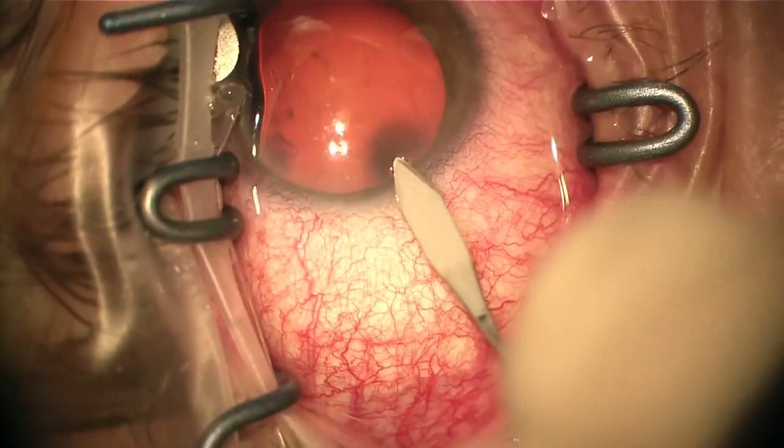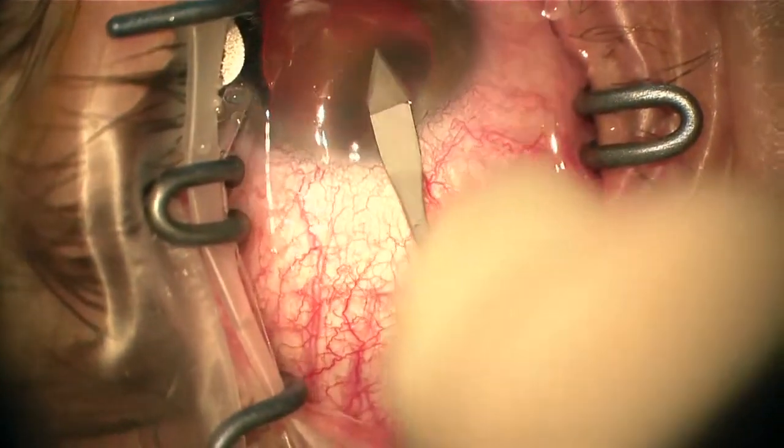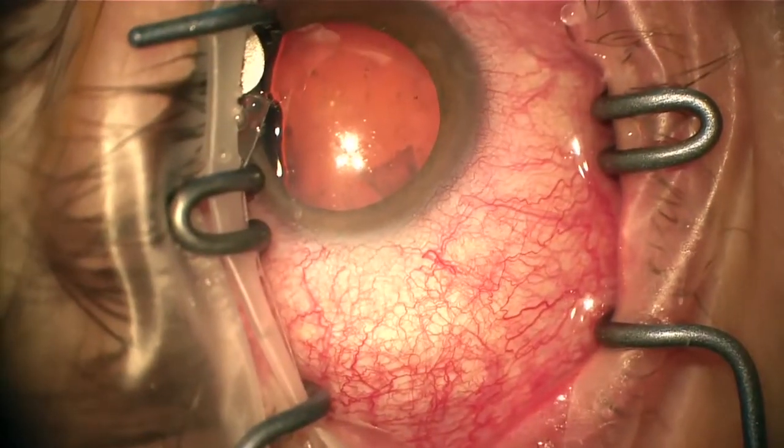Get a good microscope — very important. No viscoelastic: it traps bubbles, makes things blurry, creates optical interfaces, and you will not be able to induce hypotony. You need hypotony in order to see well. For the incision: straight, parallel to the iris, then nick left and nick right to flare it further. This allows you to extend your reach with the trabectome without creating striae. Placing it about two millimeters anterior means the iris will not come flying — a short peripheral incision will suck the iris into the wound.